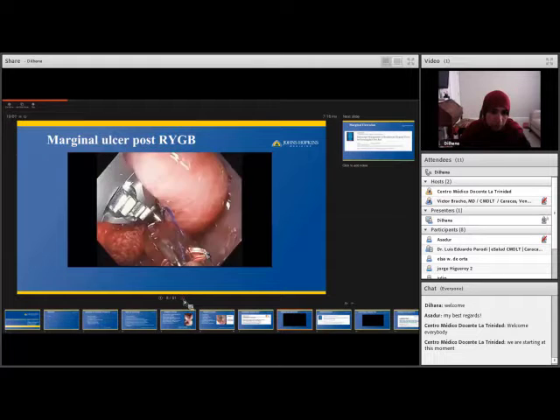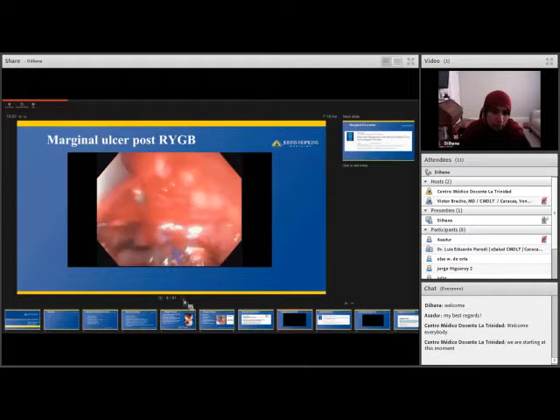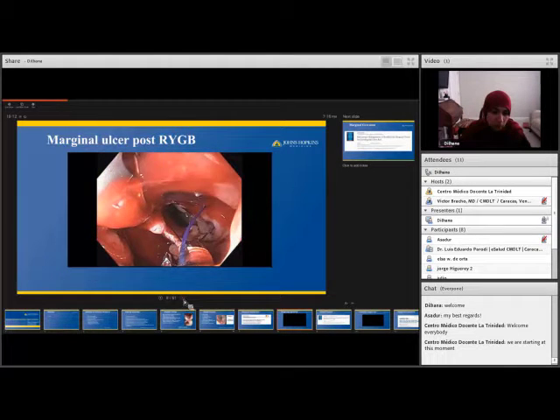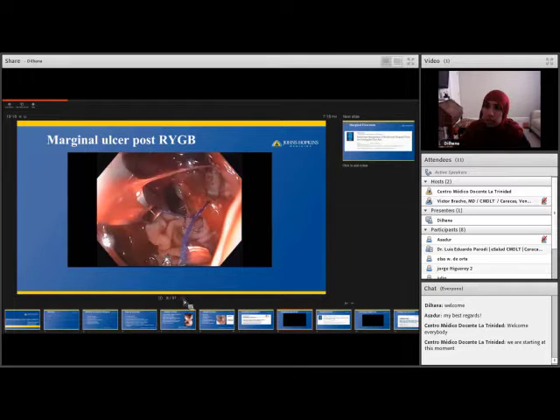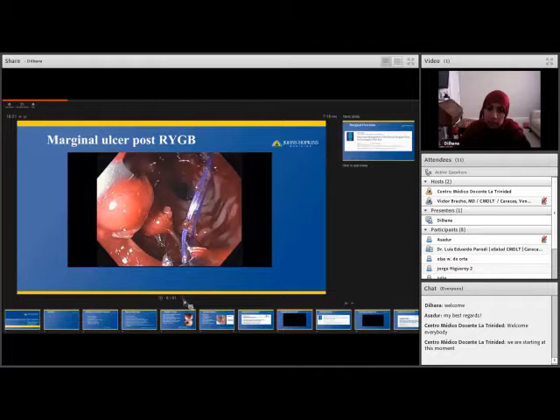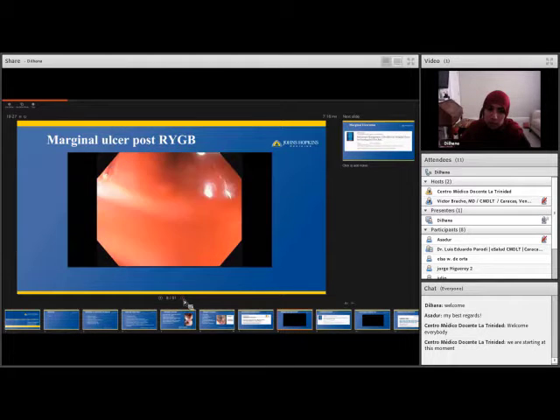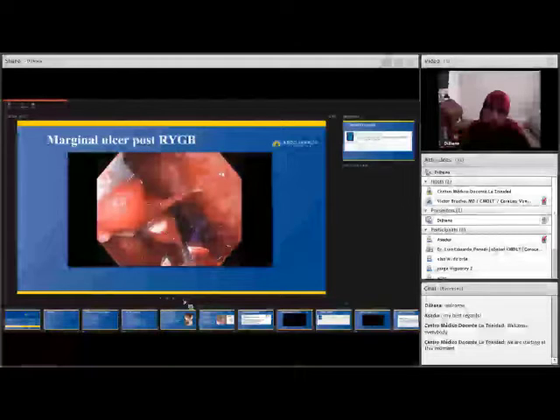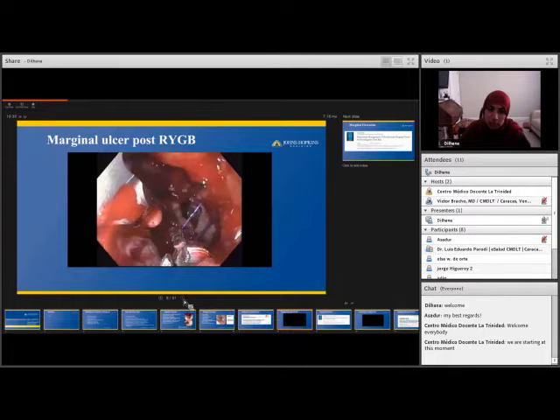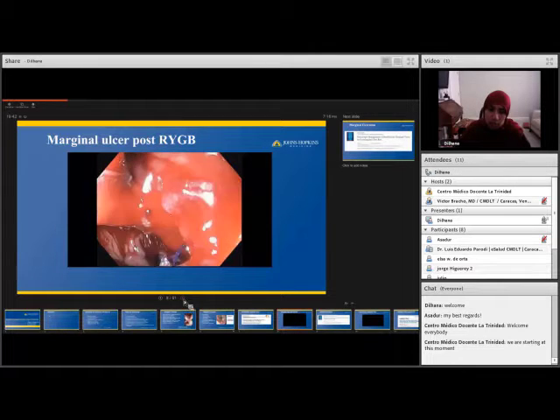The decision was made to perform dual therapy to this ulcer. So initially, epinephrine is injected into 4 quadrants surrounding the edge of the ulcer. Unfortunately, this triggered bleeding, which persisted significantly. Electrocautery was thought unlikely to benefit, and the decision was made to suture the ulcer endoscopically. Suturing is commenced from the area of bleeding on the right-hand side of the ulcer. The decision was to do a running suture pattern starting from the right-hand side and then moving to the left. So starting from bottom to top, sutures were performed.